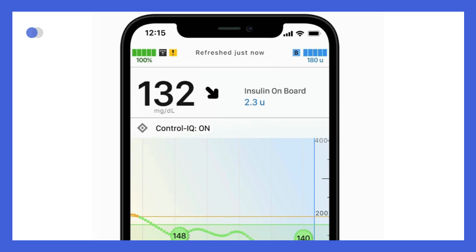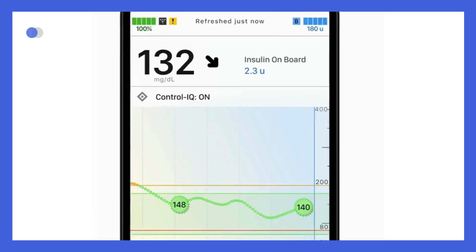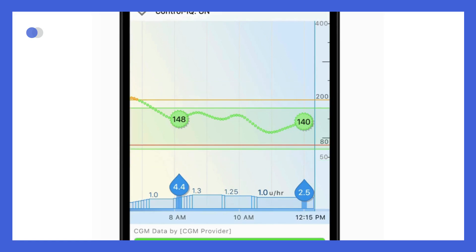Below those, insulin on board is shown. On the left, you will see the most recent glucose reading with a trend arrow. In the center of the dashboard is the graph of the most recent glucose readings. This graph displays sensor readings for the last 24 hours. You can swipe left and right to see all 24 hours in the graph. The graph includes glucose values that were entered into the bolus calculator, shown as a circle on the graph.